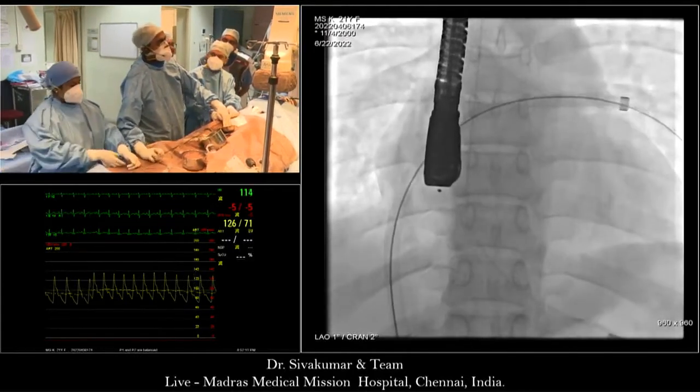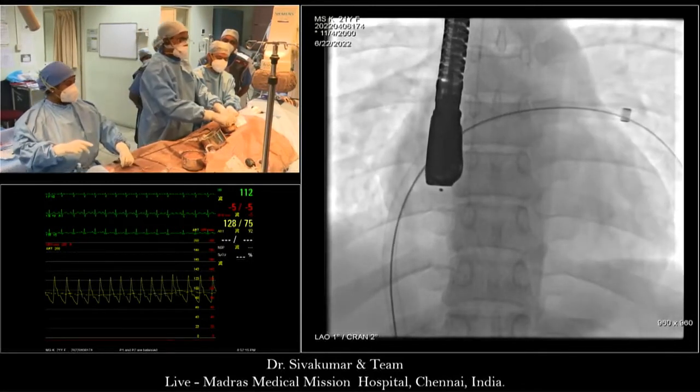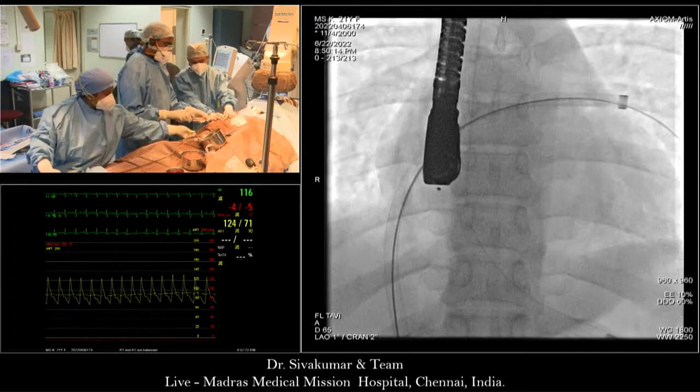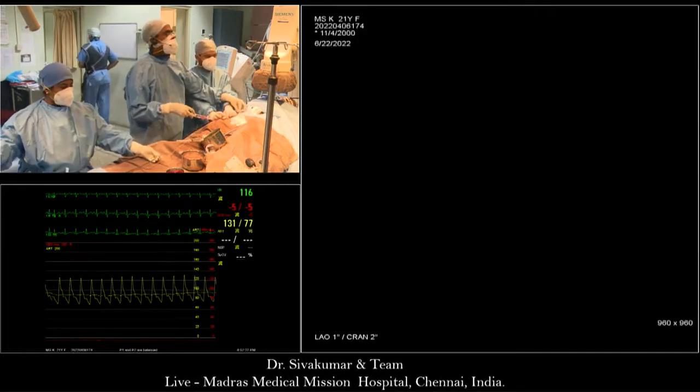Retry a 36? Yes, that's what Mario recommends, but with a different technique. Steve, do what you need to do. But it must be pretty late over there. So, Shiva, I don't want you to get so exhausted you can't make a decision. So you do what you're comfortable with.